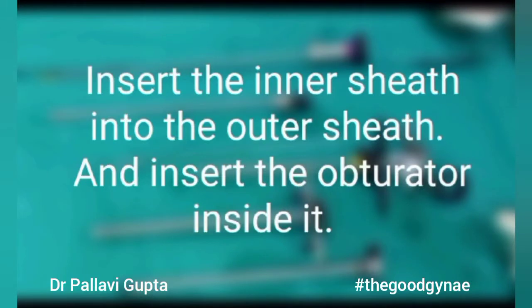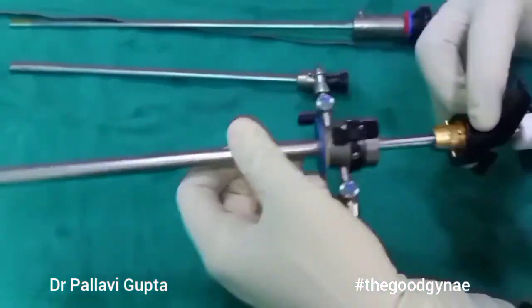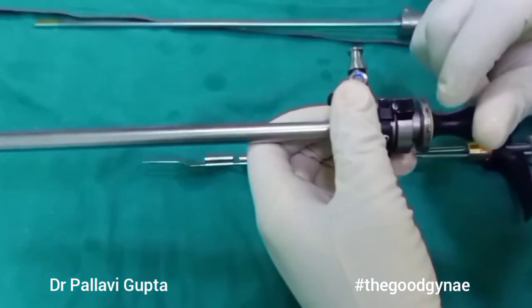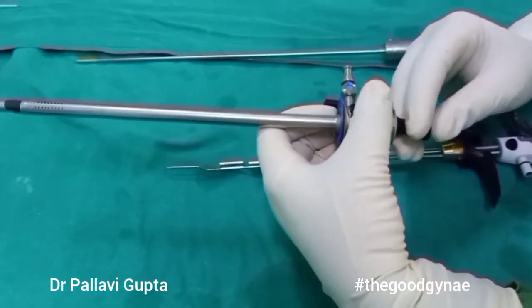Now we are going to take our sheaths and the obturator. The inner sheath is going to go inside the outer sheath. It is locked, and then our obturator is going to go inside it. The main work of the obturator is that it is going to obliterate the hollow sheaths and help in insertion of these sheaths inside the cervix.